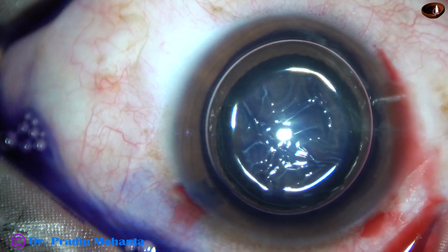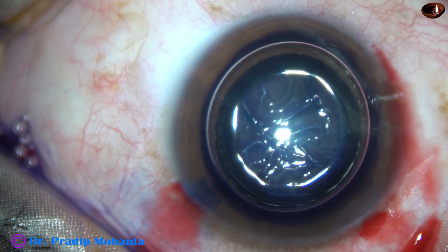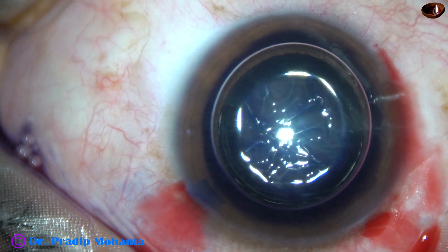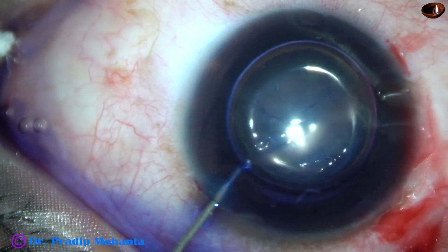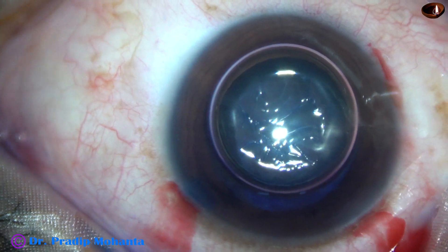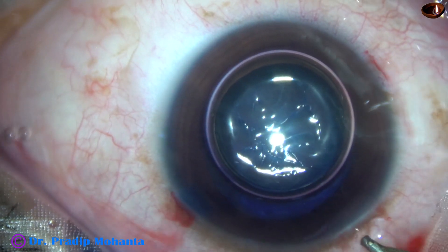We can see a wrinkling of the anterior capsule because of contraction of the underlying fibrous sheet. The anterior capsule is adherent to the subcapsular fibrous tissue, the fibrous sheet.